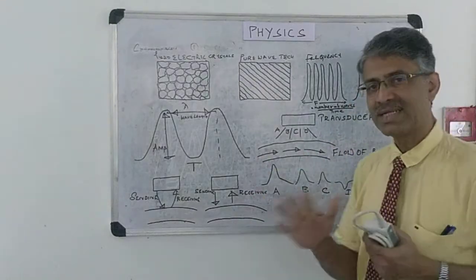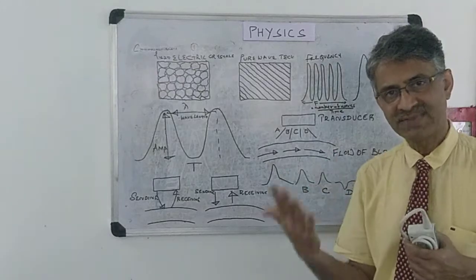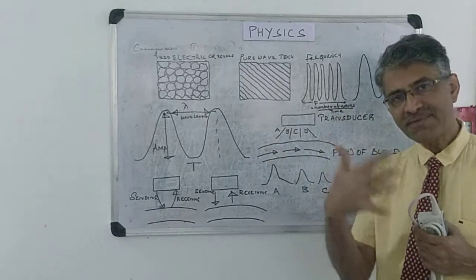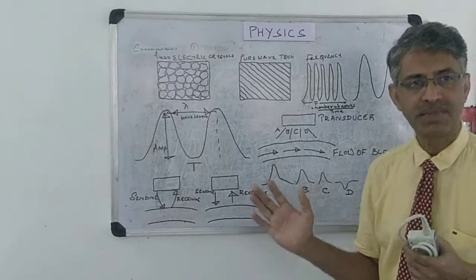With color Doppler, you can know the velocity of flow and also in which direction the blood is flowing. Usually when the blood moves towards the probe marker, it becomes red, and when it is away from the probe marker, it becomes blue. That is the reason for a principle called the BART principle.